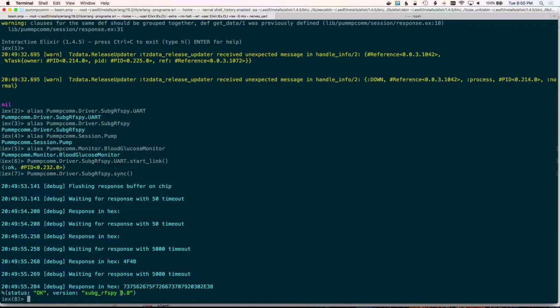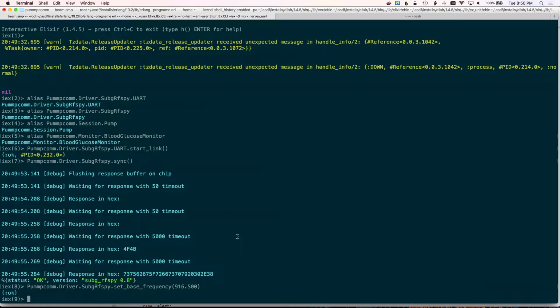Right now I'm running on 0.8 of this firmware that Pete wrote. 0.9 is out, so I'll eventually upgrade to it, but this just basically tells me I can talk to the chip. Next I'm going to set the base frequency to something close to what my pump is operating at. Different Medtronic pumps operate at different frequencies, and they're not tunable in any way, but the chip that we're using to talk to them is tunable. And so as a result of that, we can sort of call them up on their frequency, even though we know that they can't change theirs.